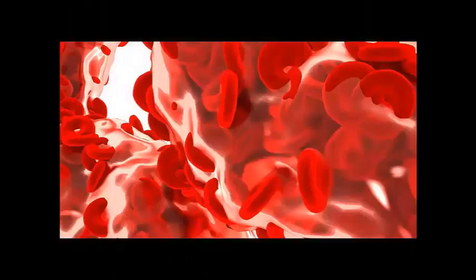MCV is the average volume of red blood cells. MCH shows the average weight of hemoglobin in a red cell, and MCHC represents the average concentration of hemoglobin in a red cell.